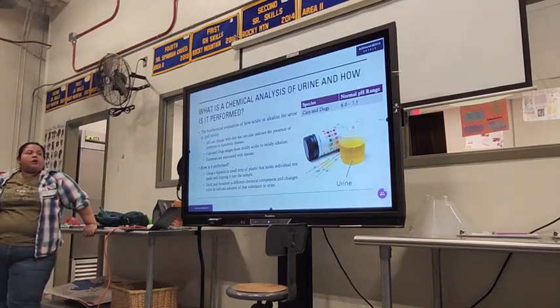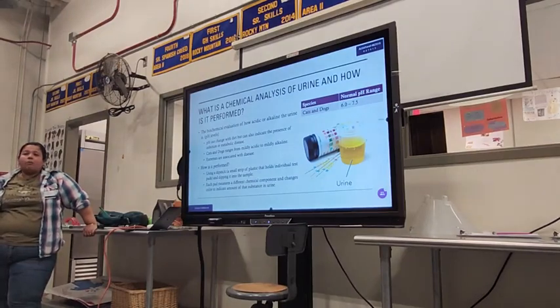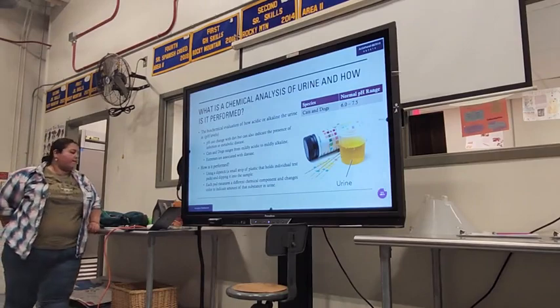Okay. So on this dipstick, each pad that's on there measures a different chemical compound or component and changes color to indicate how much of that component or that substance is in the urine. Okay. I also have a video for this.